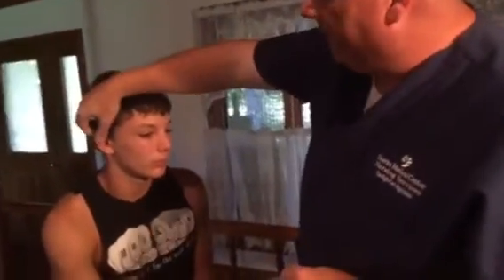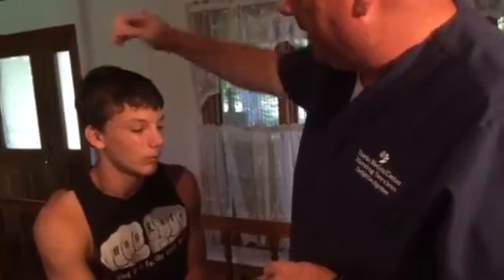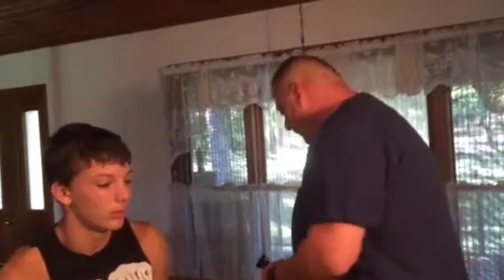So next we're going to go to the ears. We want to pull on the pinna and check for pain. Make sure they don't have any pain in their ears. We want to look for any drainage, lesions, redness, anything like that. I don't see that. We have no pain. You want to do an inspection with your otoscope.